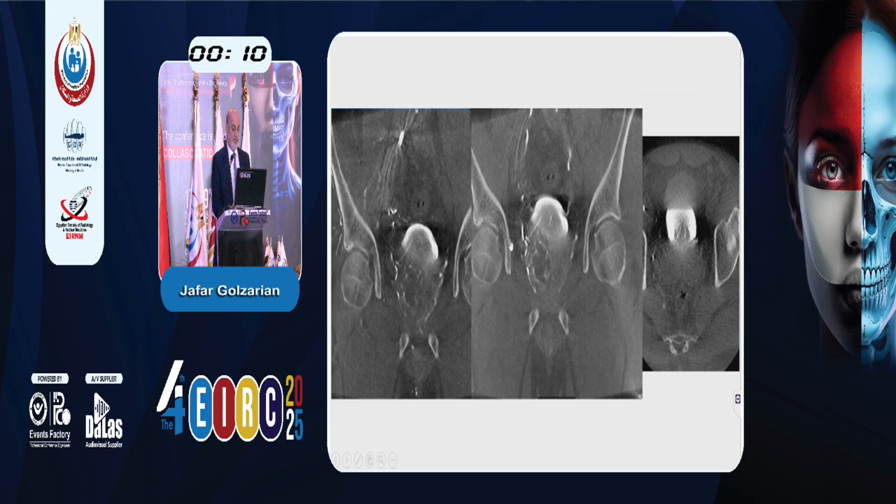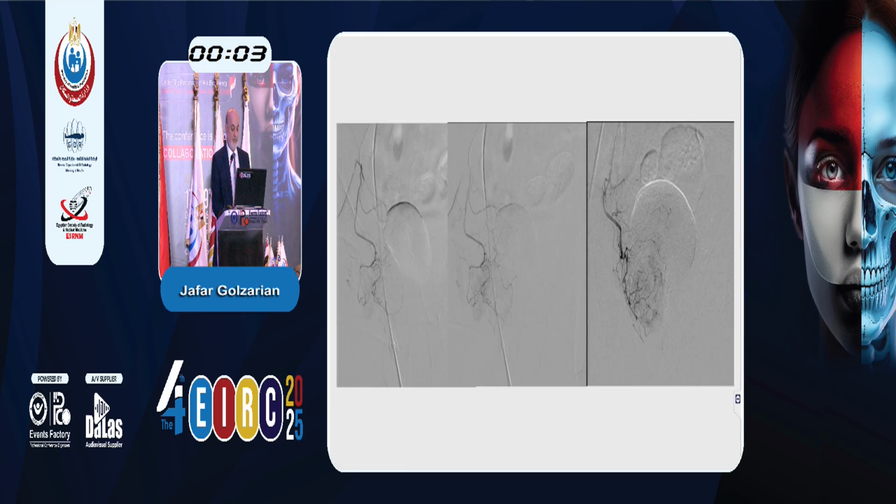So we went ahead and catheterized. You can see here the area that is missing, so we know that there is another artery there. We went to selectively catheterize that vessel that goes to the prostate. When you look at it, it looks like a juicy prostatic artery. Very often, without cone beam CT, I would stop here.